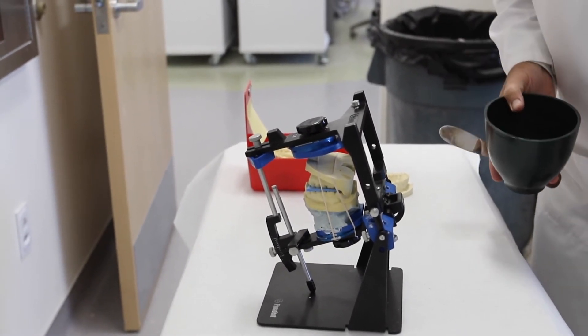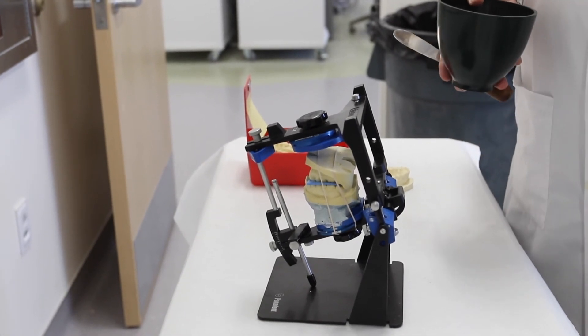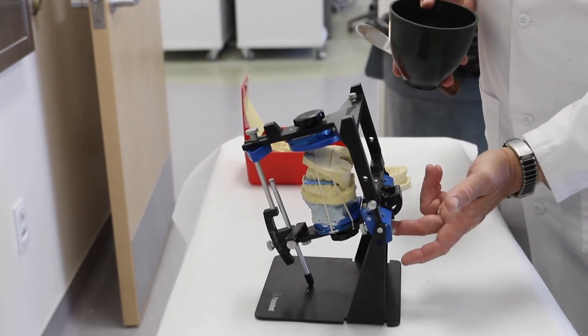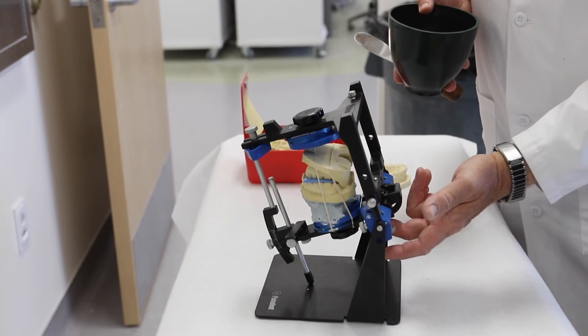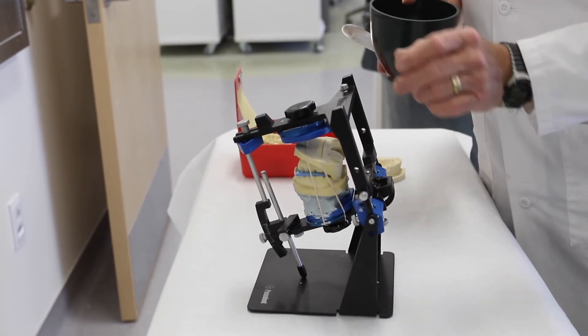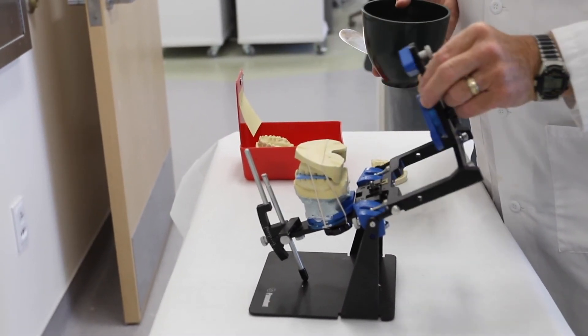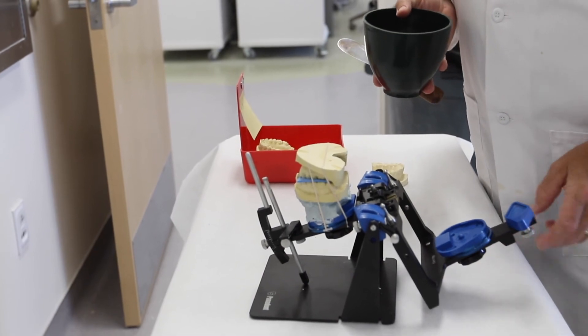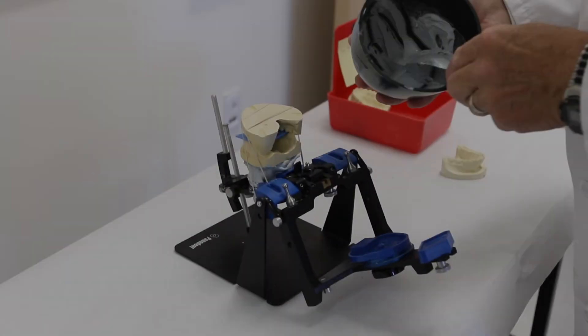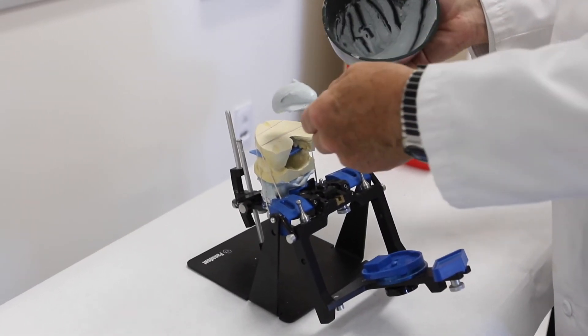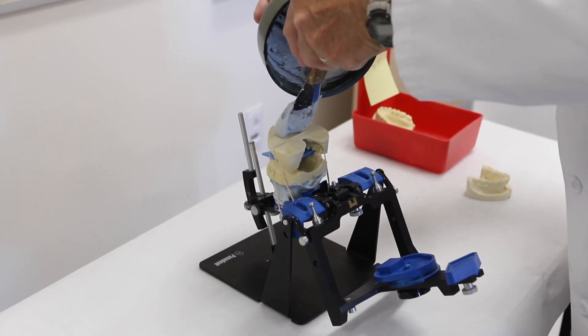It's also important when you're doing the lower mounting, since it is a centric mounting, to make sure that your centric lock pin on the articulator is engaged and you're working in the hinge axis of the articulator for this mounting. Now that you've mixed your mounting stone, place it in position.